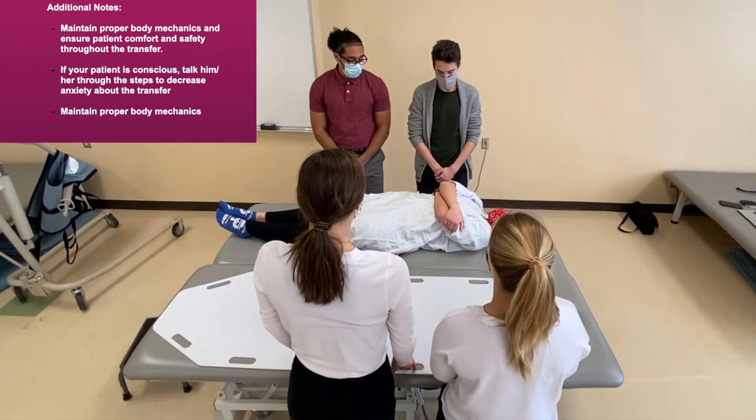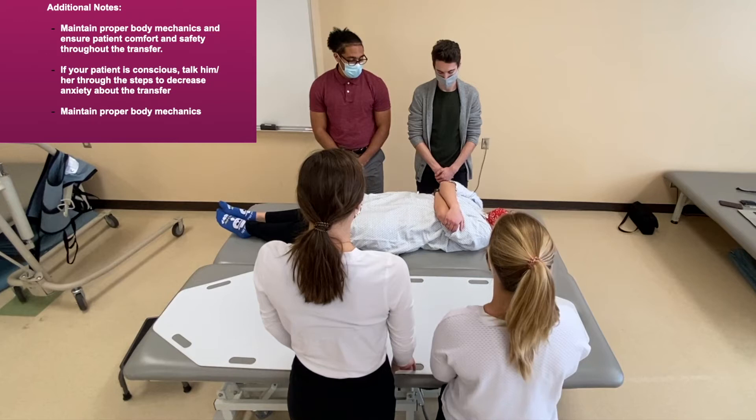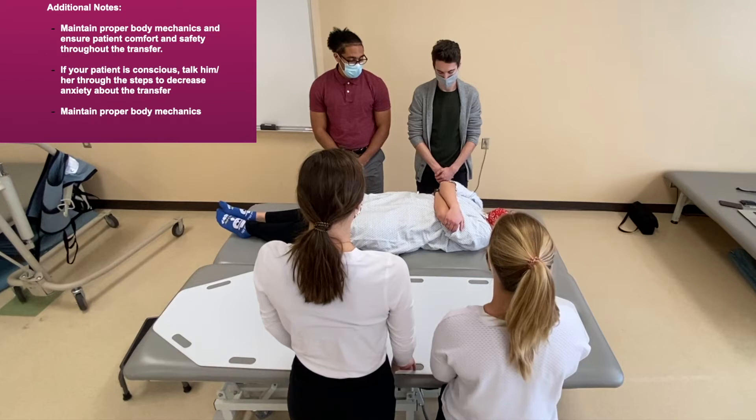If your patient is conscious, talk to him or her through the steps to decrease anxiety about the transfer.